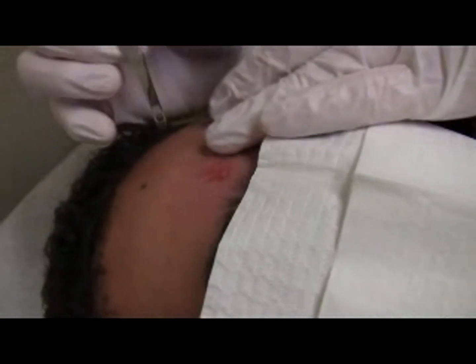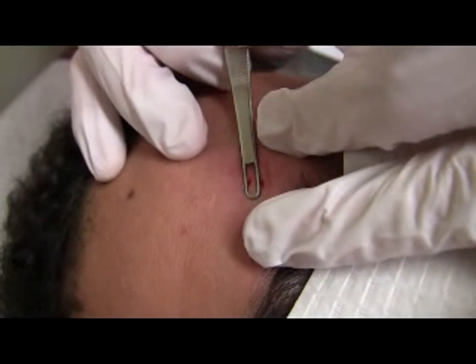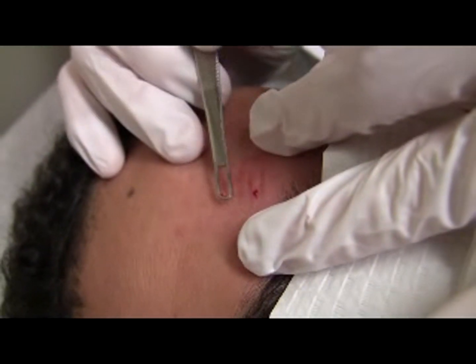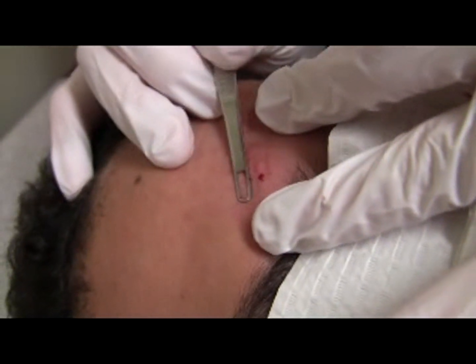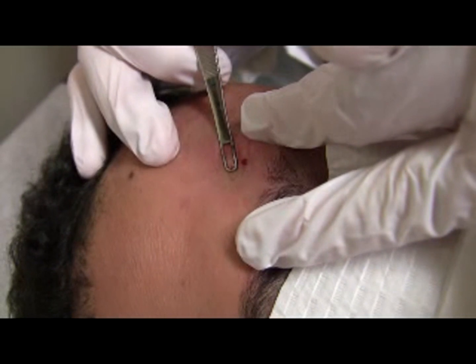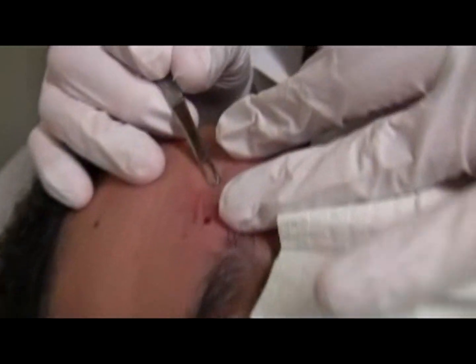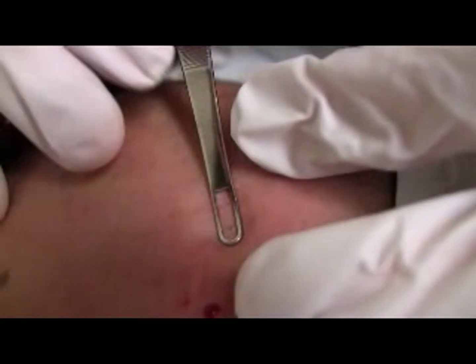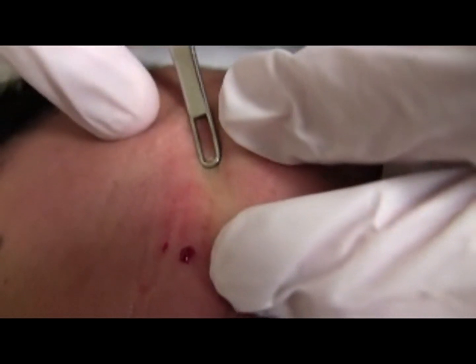On the buccal cheeks and inferior eyelids, downward pressure results in significant displacement of the skin. For the cheeks, don't be shy. Sometimes you don't even need to make that incision — I can just do this and you see how some comedones come out. If I just put pressure, it comes out too, without the nick.